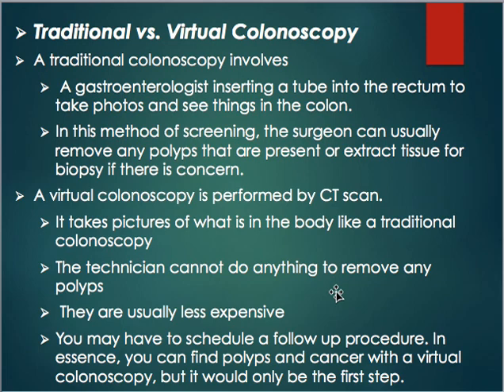So if a patient's already had polyps before, or it's follow-up scans for cancer, they're not going to want to do a virtual colonoscopy. They're going to want to do the traditional one so that they can go in and do any testing that they need to do. But it's still a nice option to have for individuals that have never had any issues, that they can go through and look at it.